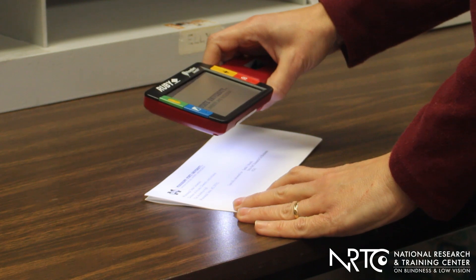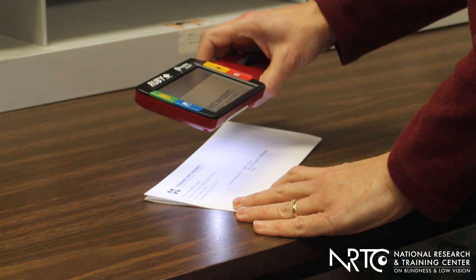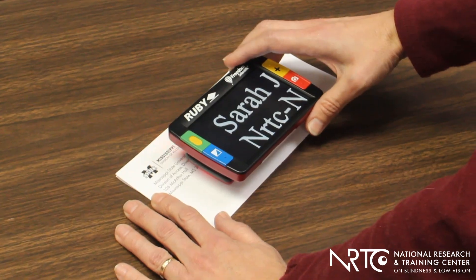This one can be used in two different configurations: either as a magnifier, just holding it by the handle and over the print that the individual wants to read, or you can fold the handle underneath and set it directly on the page so that it stabilizes the image and it's not bouncing around quite so much. Also, you can just slide it across the page to see an entire sentence if you need to read more than just a few words at a time.